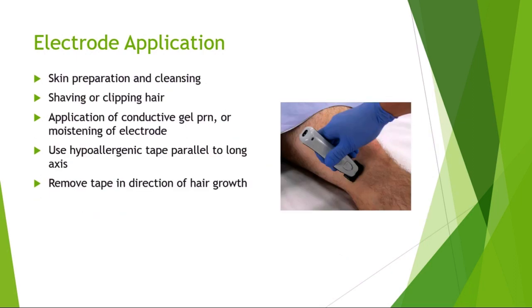We'll talk more about skin prep in lab. You want to make sure the skin is clean and oils are removed. If they're too hairy for the electrodes to stick to them, then you need to shave or clip hair or have them do it before they come in. A lot of times when we're doing functional electrical stim, we will coach the patients in the session before their FES session where to shave or clip their hair before the session, or their spouse or caregiver.